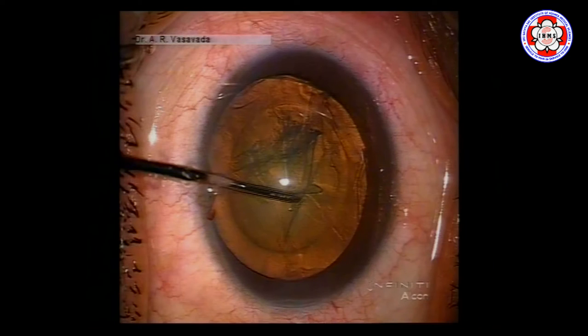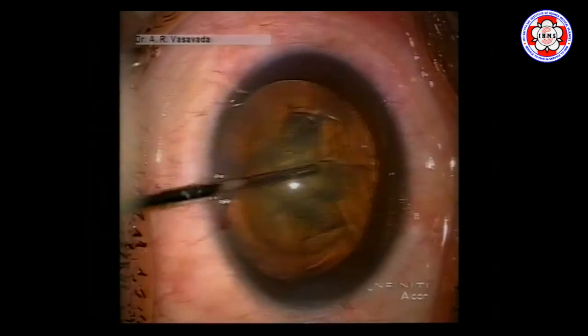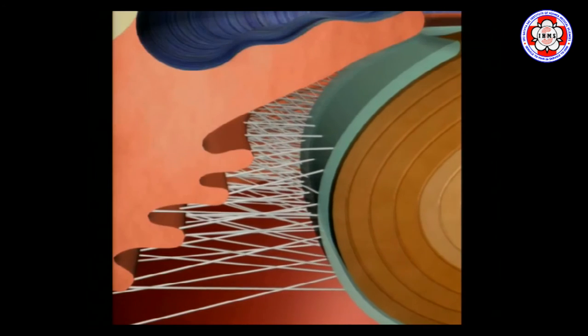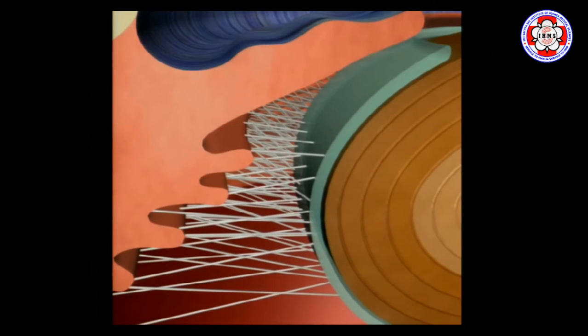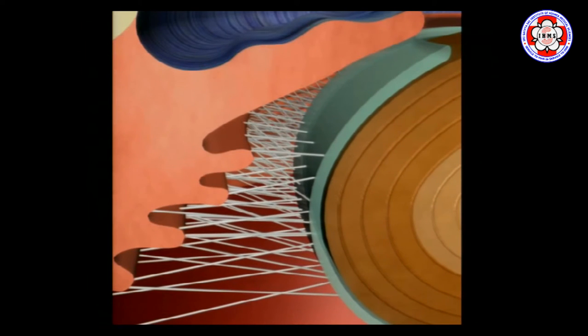In this patient, although a good hydrodissection was done, the nucleus is not rotating. Any extra maneuver you attempt is going to transmit force to the zonules. You can see the stress being put on the capsular bag — at some point you can cause a dialysis or zonular weakness, because all this shearing force, since the nucleus is not moving, is being transmitted to the ciliary body and the zonules.